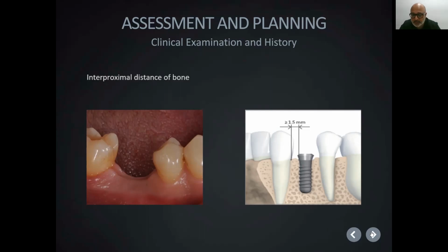So with a 4 mil implant, if I can place it everywhere, I will, because it will support a molar, a premolar, a canine, and incisors. But quite often in the incisor region, other than the upper central incisors, it tends to be too big. So in that situation, if you had a shortened gap, you could use a 3.75, that's the other BLX, or the BLTs then go down to a 3.3 and down to a 2.9.